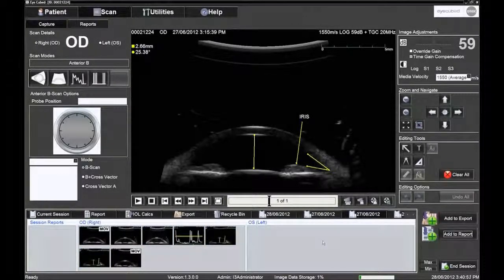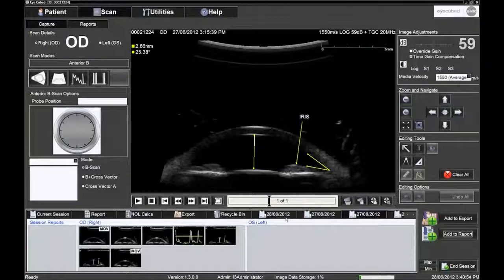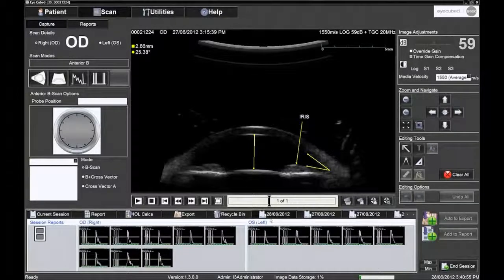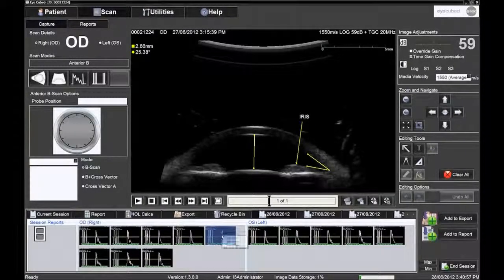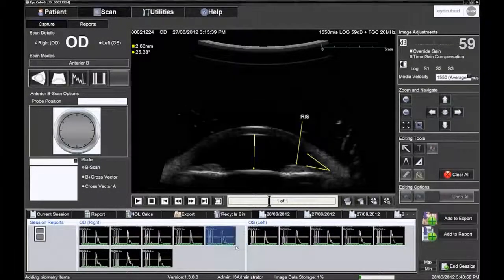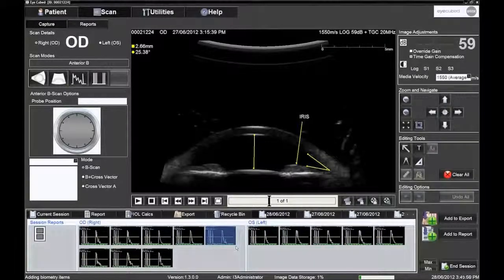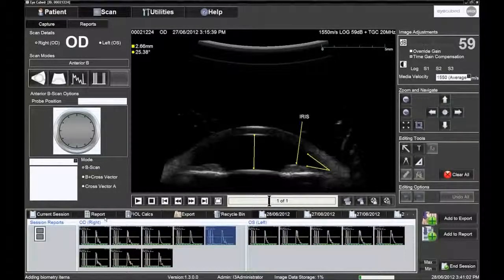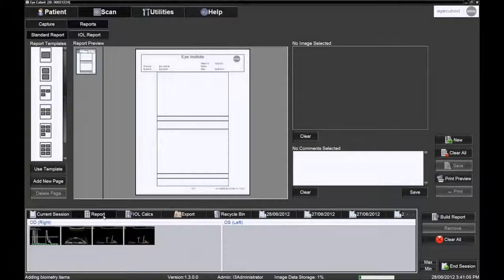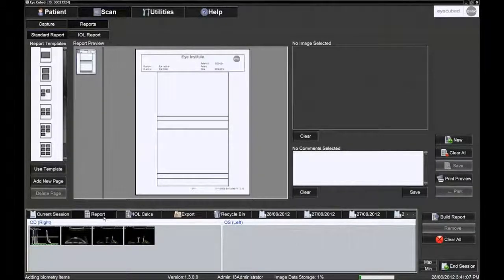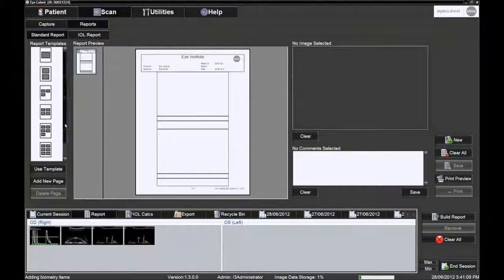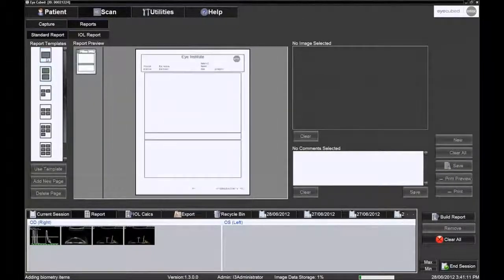Scans from multiple visits can be selected and sent to the standard report bin. The standard report page can be accessed by clicking the report icon. The appropriate report template can be chosen via the left column labelled Report Template by simply double clicking it.